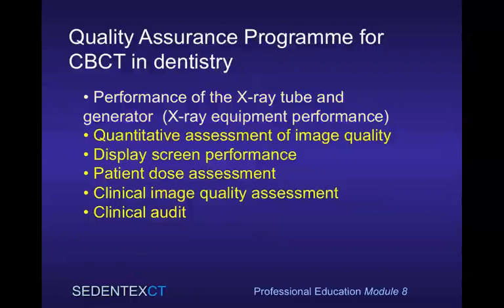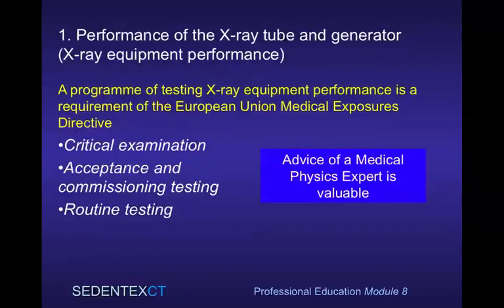First of all, performance of the X-ray tube and generator. A program of testing X-ray equipment performance is a requirement of the European Union Medical Exposures Directive. It consists of a critical examination, acceptance and commissioning testing, and routine testing. For all these components, the advice of a medical physics expert is either essential or desirable.